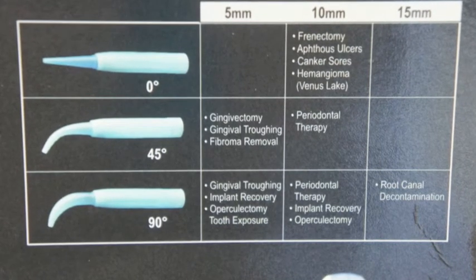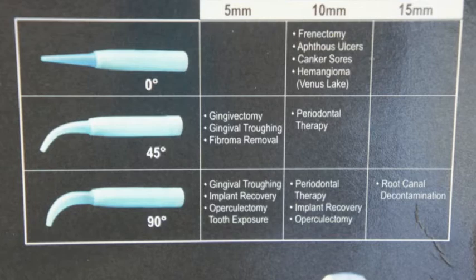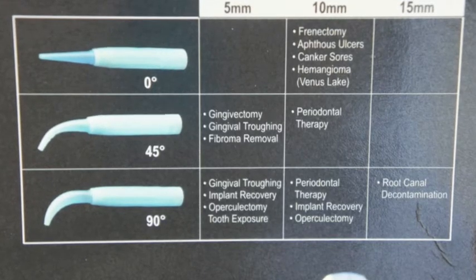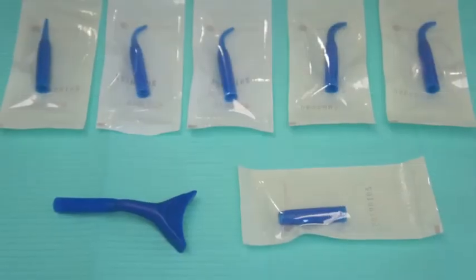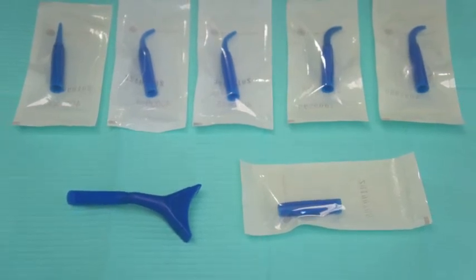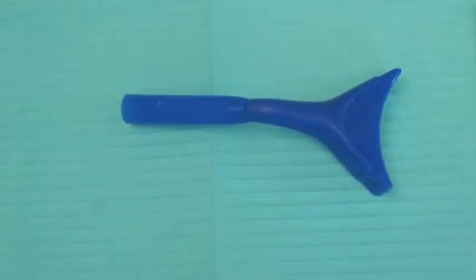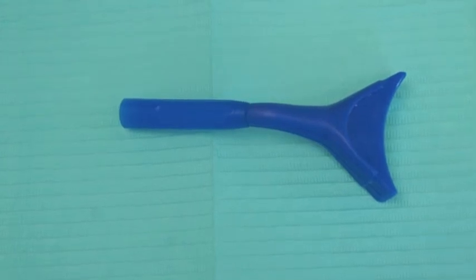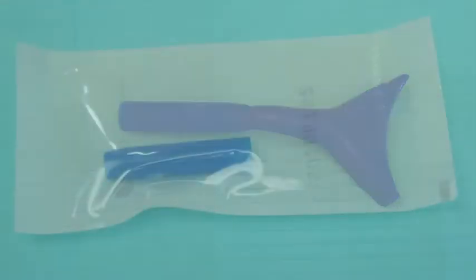Typically I like the 90 degrees 10 millimeter for most of my procedures including crown troughing. You can see here all the tips including on the top row the disposable tips and on the bottom row the bleaching tip that you see here which is the only non-disposable tip. It must be used with the Picasso 7W.